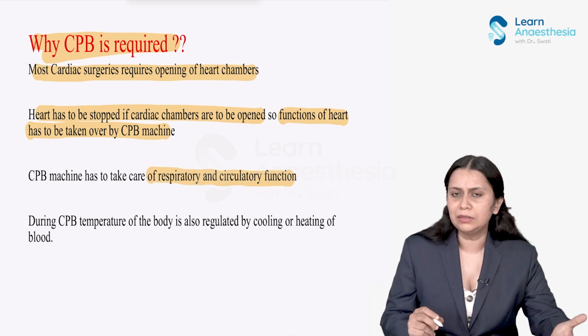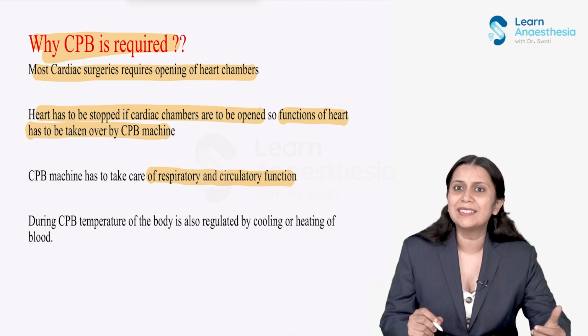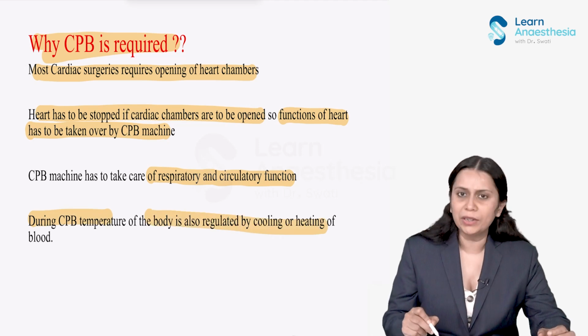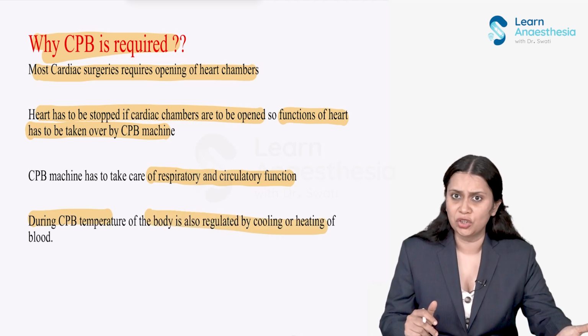And not only this, this machine also helps in controlling the core temperature of the patient, that is decreasing the core temperature, which has a protective mechanism of organ protection during these surgeries. So during CPB, the temperature of the body can be regulated. We can cool or heat by heat exchanger, right?